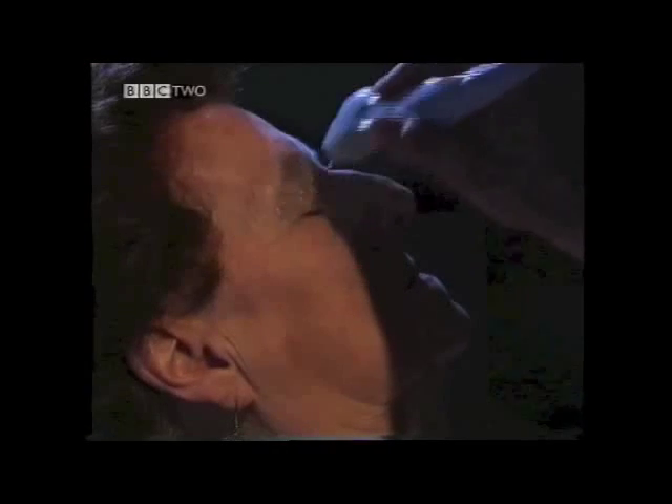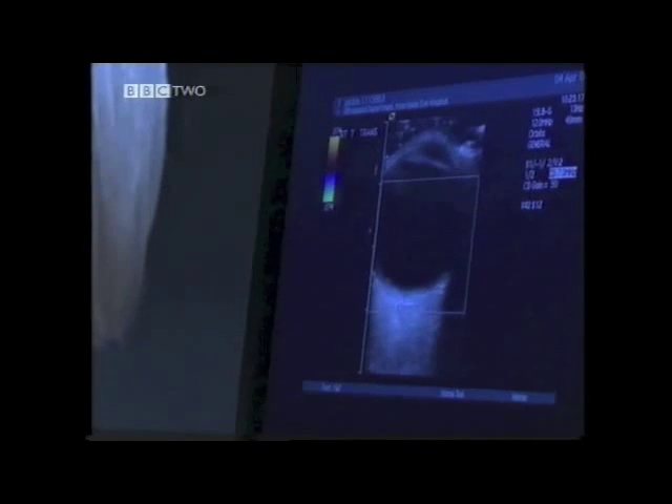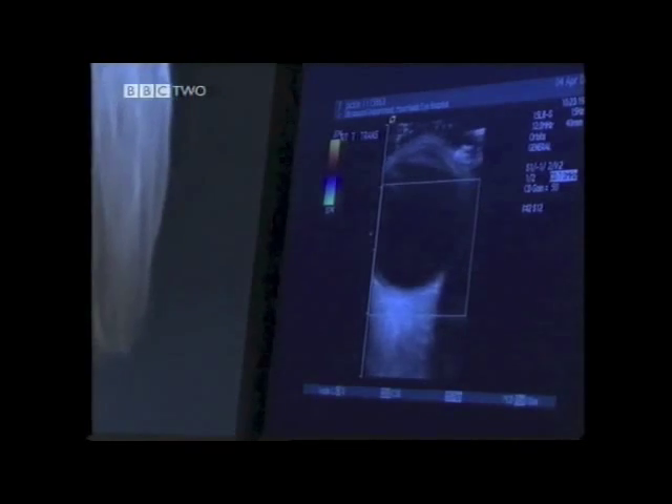The world-famous Moorfields Eye Hospital in London uses some of the most technically advanced equipment to help their patients maintain their sight. If you come forward, pop your chin down on the rest. This OCT scanner can see the retina at the very back of the eye and analyse its health.